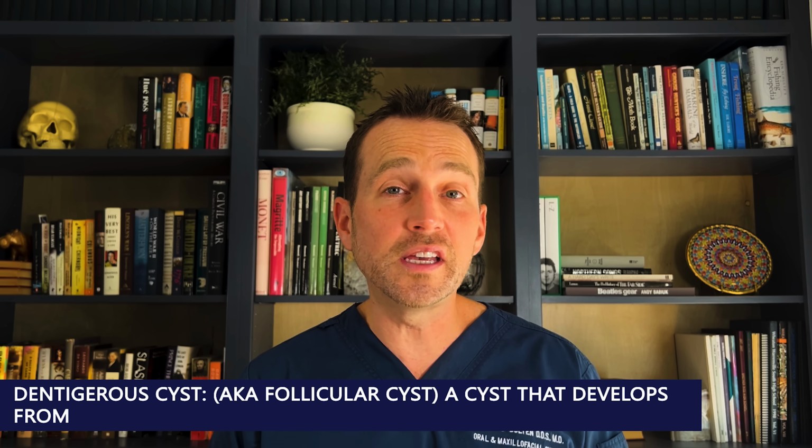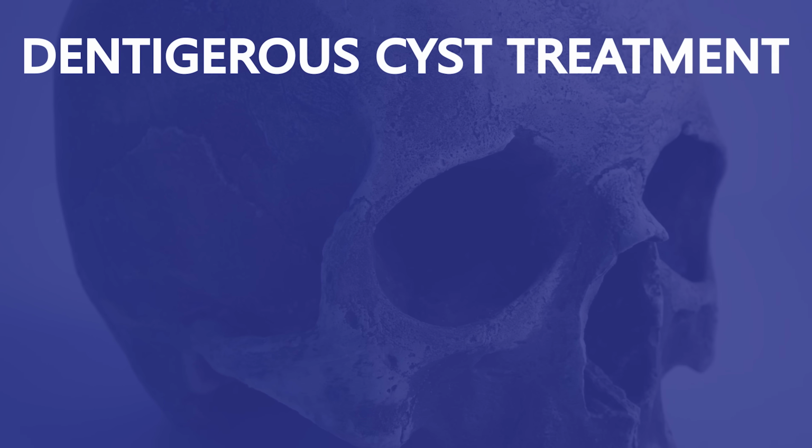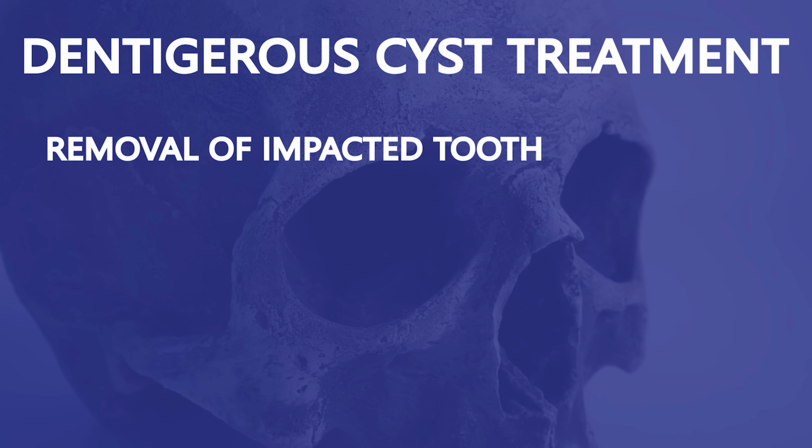A dentigerous cyst is a cyst that forms around the crown of an unerupted tooth. They're fairly common, but the vast majority are not nearly as big as this one. The treatment is enucleation, which I already did, so nothing else needs to be done. The bone will fill in with time.